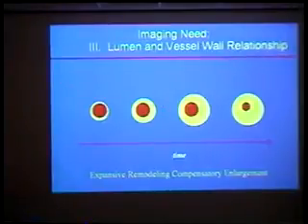What is really interesting is that if we have a way of looking at the lesion at this earlier stage, we are much more likely to treat it earlier in the process and reverse the entire process, so it doesn't even have to go to this point. With current diagnostic tools, if we simply look at the lumen, we're going to miss all lesions in this stage. Especially in coronary arteries, we're missing a lot of information by not looking at the non-stenotic part of the artery.